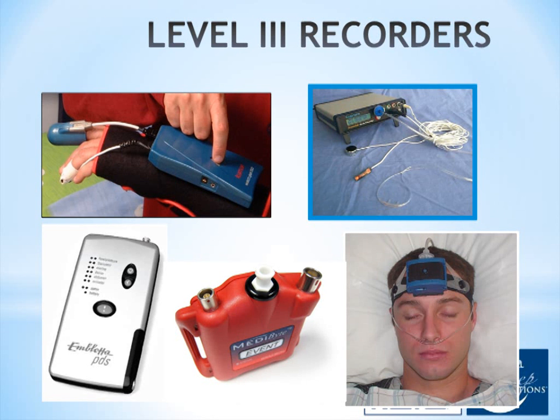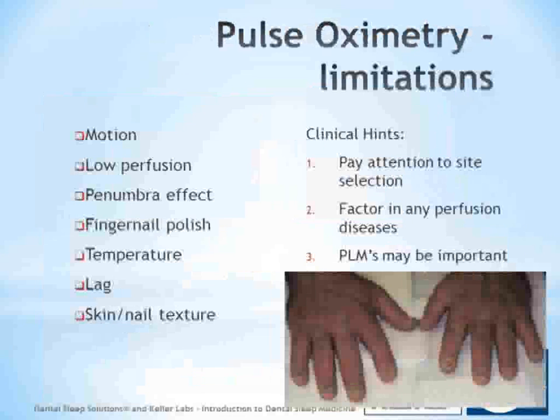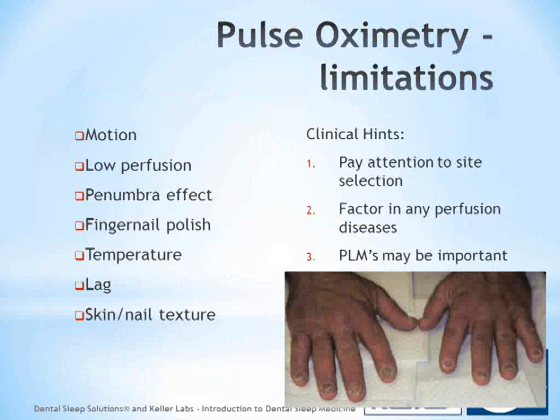And Rich, can you tell us a little bit more of how these work and in particular just sometimes when they may not work? Yeah, I have a story I'm a little embarrassed to tell, but I had a little old lady who we sent home with a home sleep testing device, and we couldn't get the pulse oximetry to work. And she was just distraught because she thought she was doing it wrong.